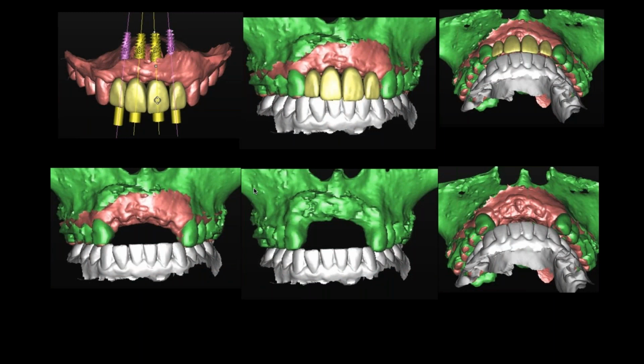So now what I did was I did the intraoral scan of her without the teeth in place, upper and lower. And so what you see on this is brought into a CT planning software called Implant. And what you'll see here is in the red on the upper left is her maxillary soft tissue and teeth. And then the green is the bone. And then on the white underneath it is, of course, her mandible and occlusion. And then the yellow teeth are virtual teeth. So I just took teeth and I put them in position. And I thought those looked pretty reasonable.